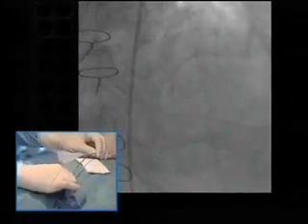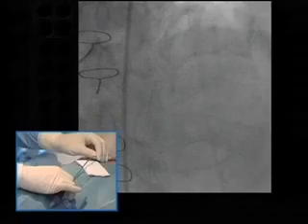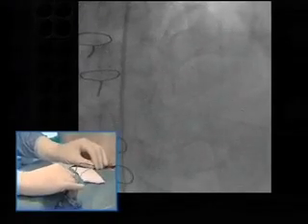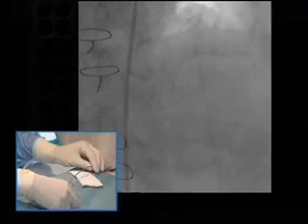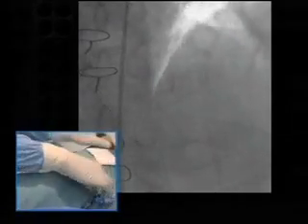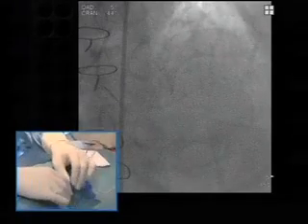There is a little bit of calcification at the level of the lesion, not very important. Okay, so the decision here is whether to approach this right up front as a two-stent procedure or try to do it as a single stent: predilate both branches, maybe leave a protecting wire down the diagonal and stent the main channel with a drug-eluting stent, then go back to see what you can do to the side branch.